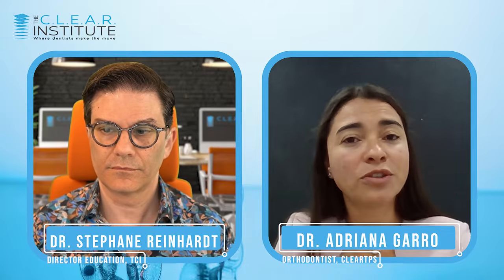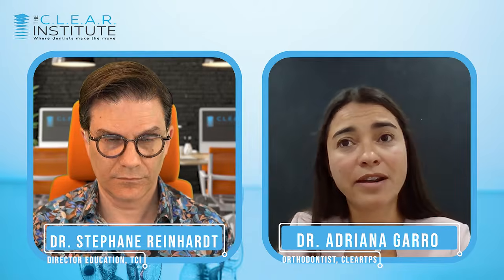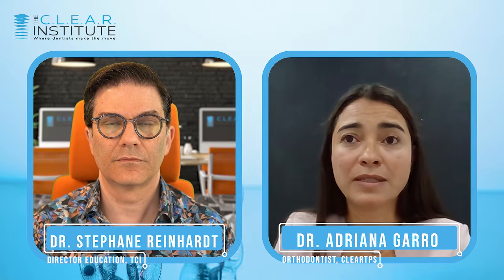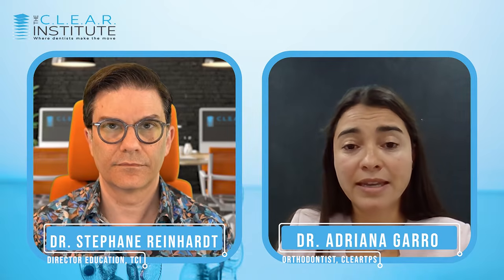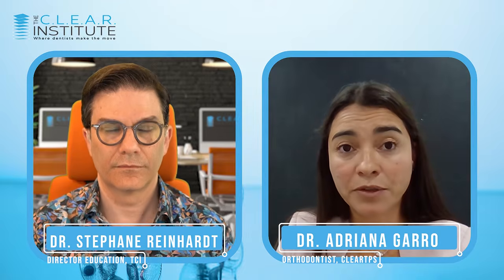Very good. I want to say something before we move forward to the patient. It is the reason why a doctor will use a treatment planning service. There are two reasons that I have found through the years. The first reason is because the clinical knowledge and experience with clear aligners is not that much, and the doctor is beginning the learning curve.